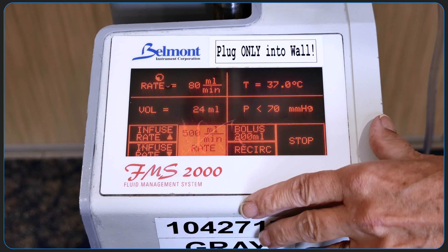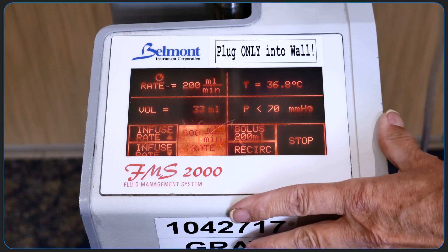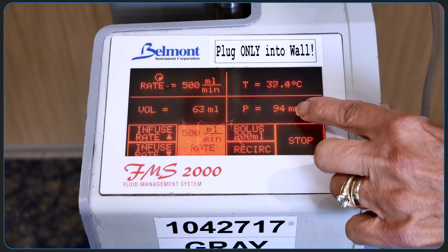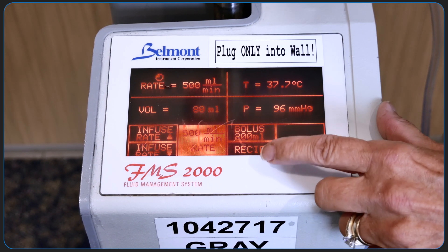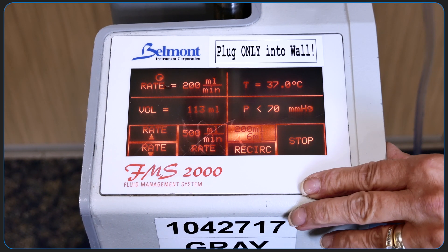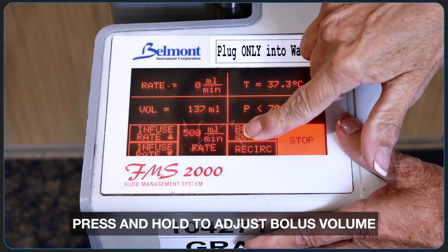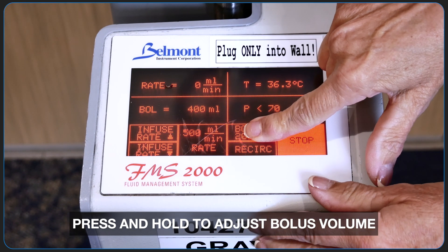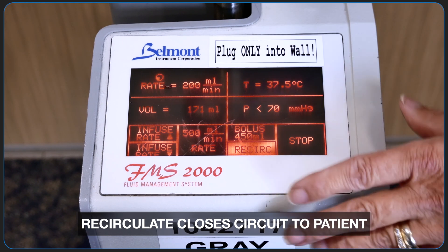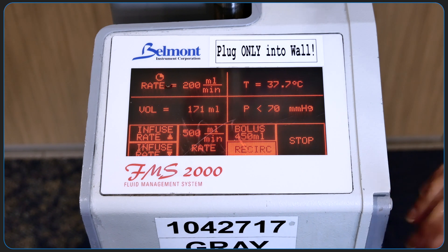Let's start by going directly to a rate of 500cc. You can see the rate starting to rev up and you can also monitor the increase in the line pressure. If you want a bolus, you can hit the bolus button, and to change the bolus volume, you can hold it and it'll circulate through the list of available options. Now the bolus volume is set to 450cc. The recirculation button manually closes off the circuit to the patient and purges any air from the system. After every 500cc, the system will automatically do this.